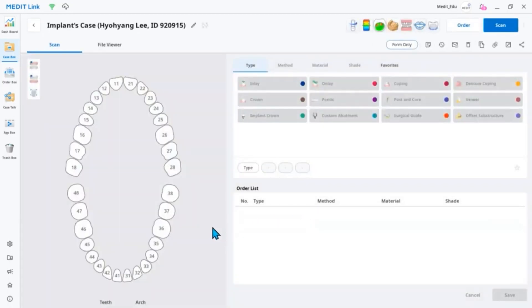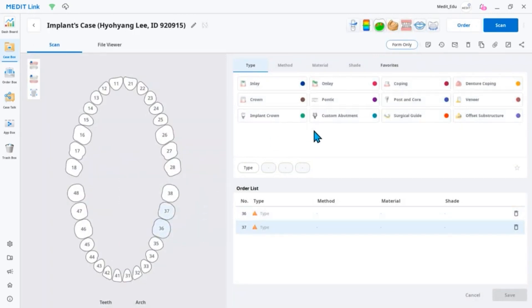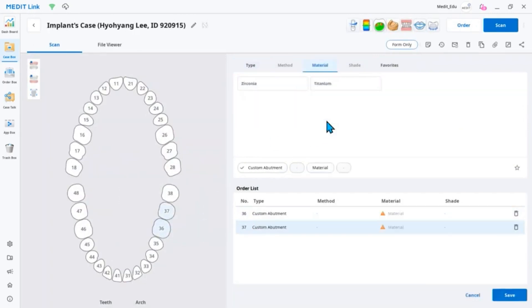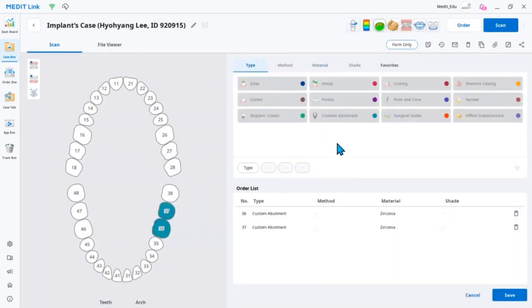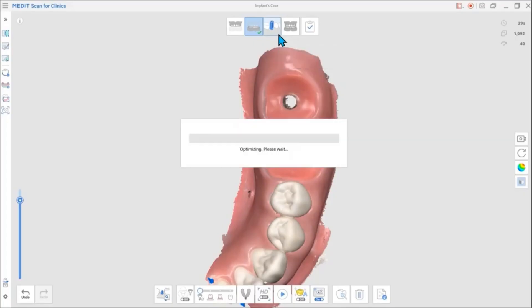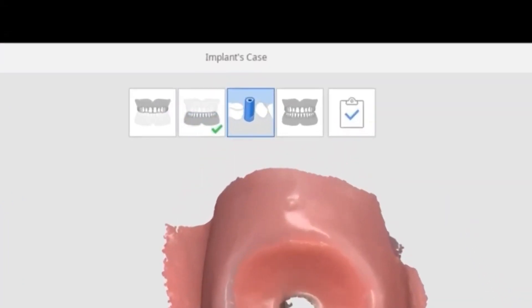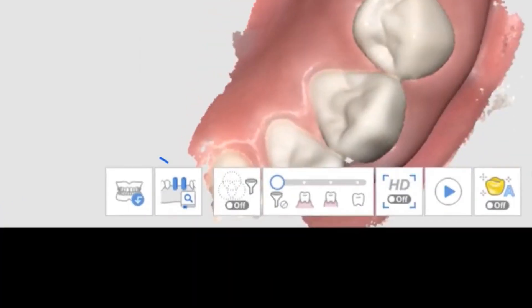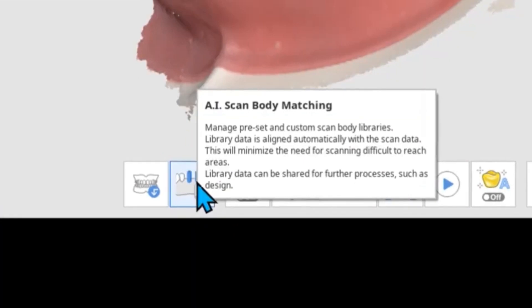AI Scan Body Matching can be used in the Implant feature. Select an implant-related type when entering form information. The AI Scan Body Matching feature is located at the bottom of the Scan Body stage. Click AI Scan Body Matching to see the Scan Body Library dialog window.